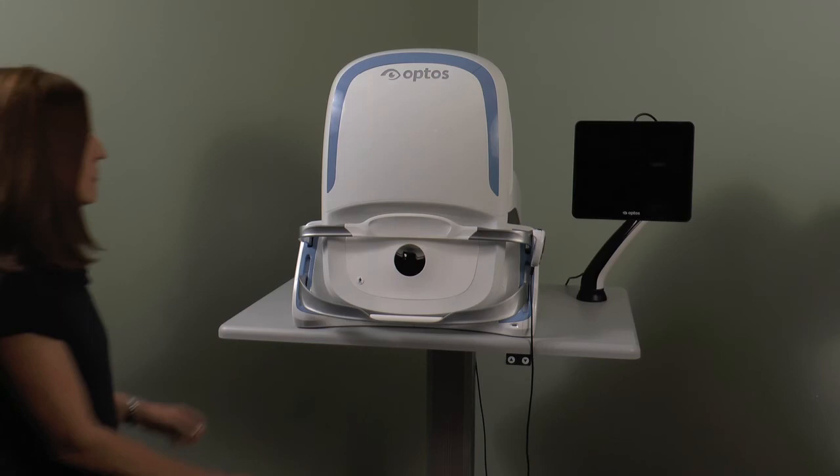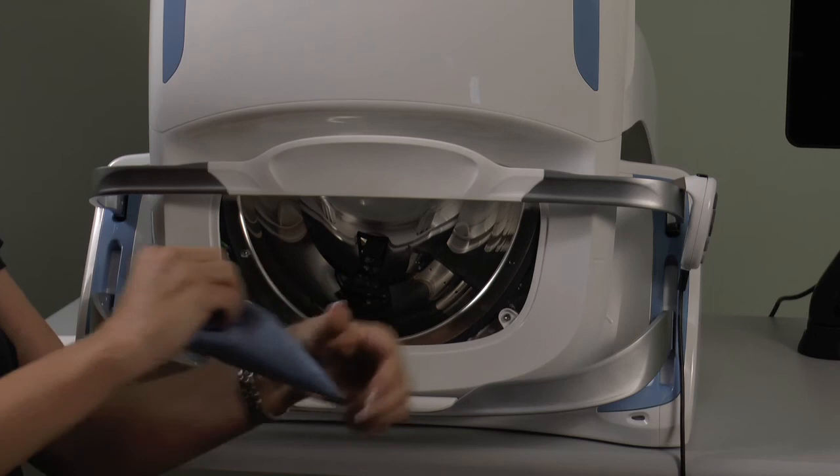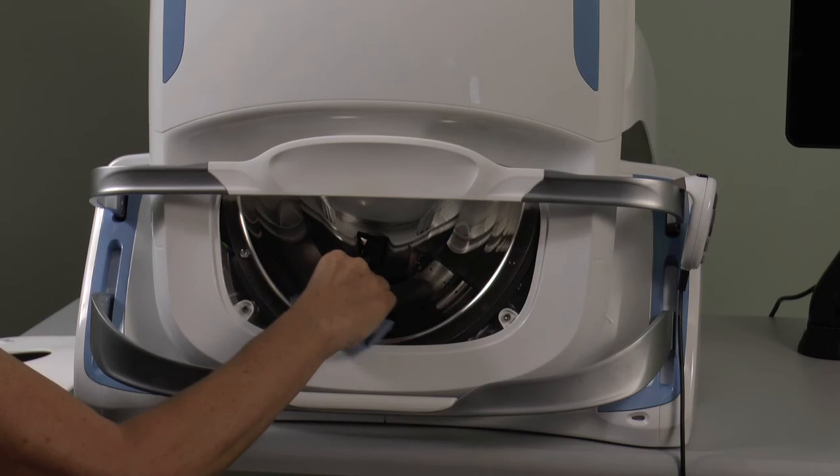Over time, dust may accumulate on the mirror. To clean, remove the face pad and fold the corners of an opti-wipe together as shown. Then carefully reach into the cavity and, using light downward strokes, wipe any dust particles off the mirror. Ensure no jewelry is worn on hands to avoid scratching the mirror.